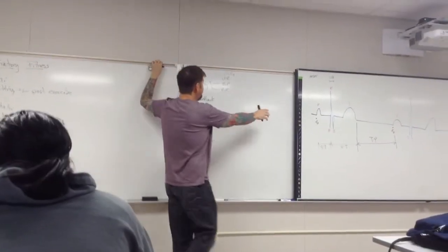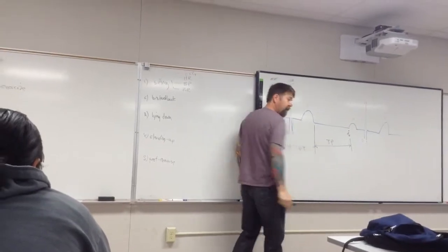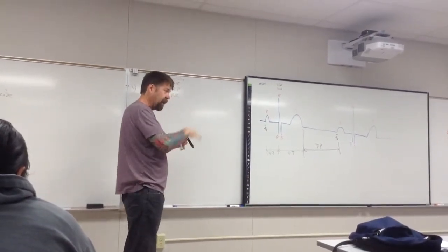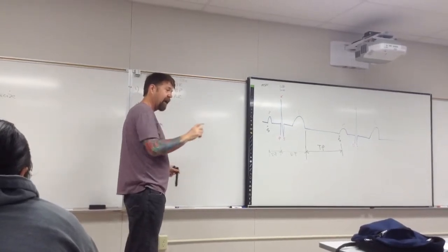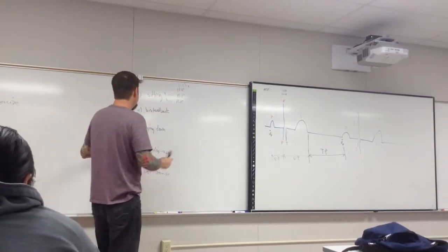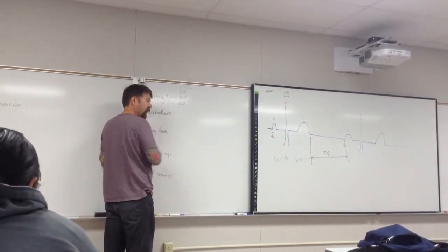With the ECG, what we want is all these intervals. What are the QRS, QT, and TP intervals? What are those data? And you're going to have to do the EKG. Remember how we clicked and dragged to measure delta T on that, BIOPAC and all that. We're using the same stuff again to do that. And then get the numbers, then repeat it for biofeedback.